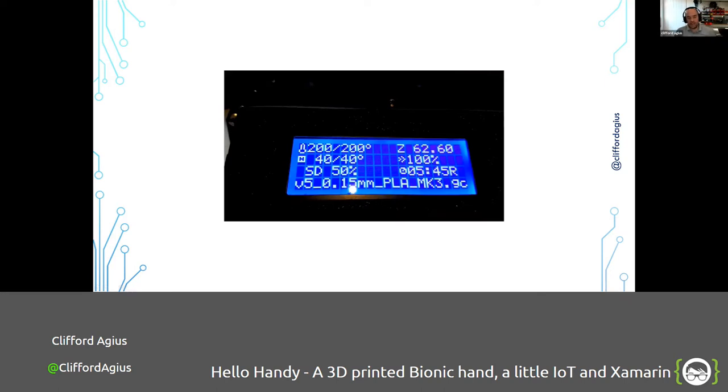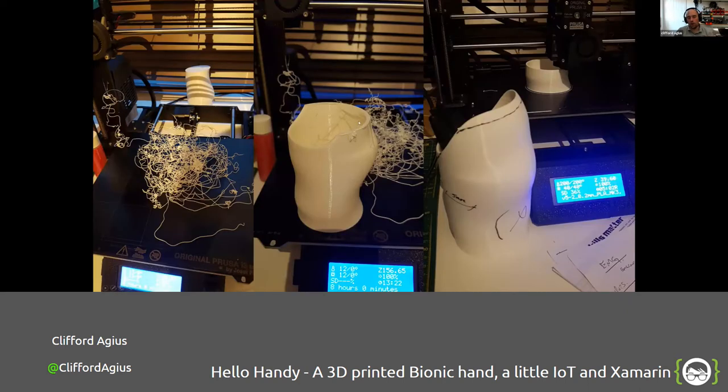I thought all was well, so I went to bed — I normally leave the printer running all night. The Prusa printers need very little monitoring. But I came back in the morning to find that it got almost to the end, detached on the print bed, knocked off the back, and I ended up with a bit of a spider's web. But it printed enough for us to try it.